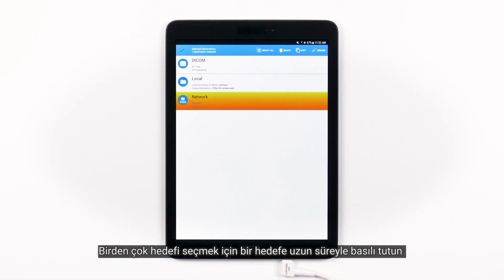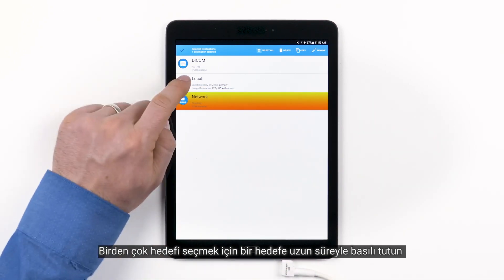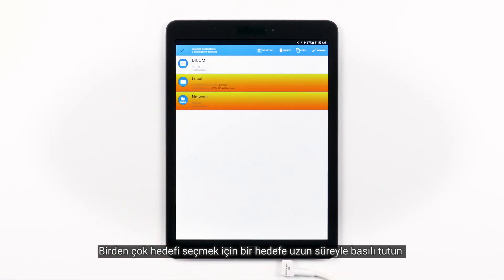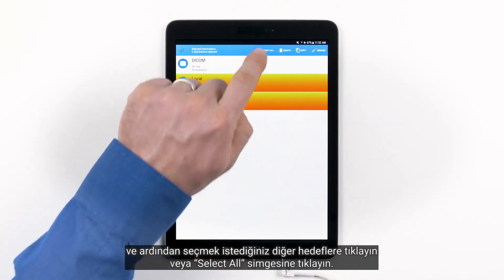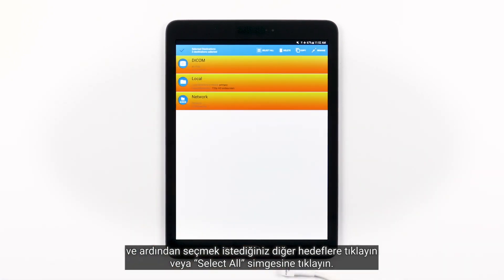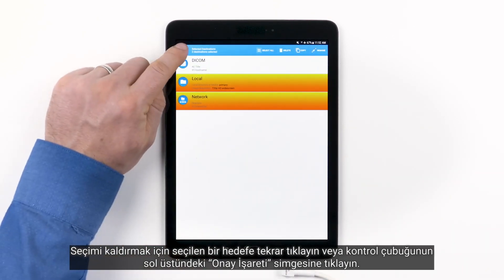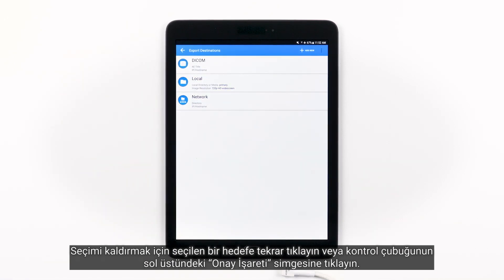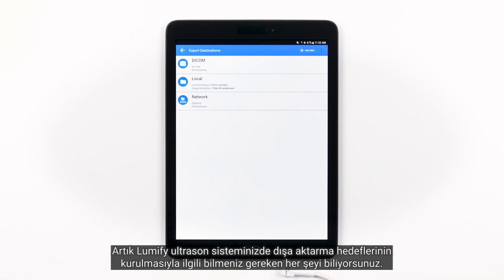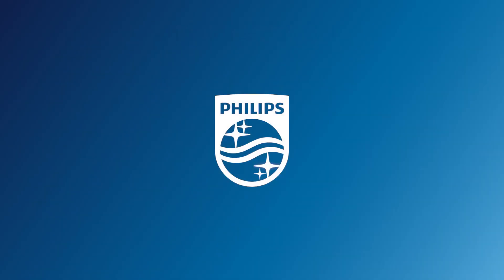To multi-select destinations, long press on one, then tap the others you'd like to select, or tap the Select All icon. To deselect, tap again on a selected destination, or tap the checkmark icon in the top left of the control bar. Now you know everything you need to know about setting up export destinations on your Lumify Ultrasound System.